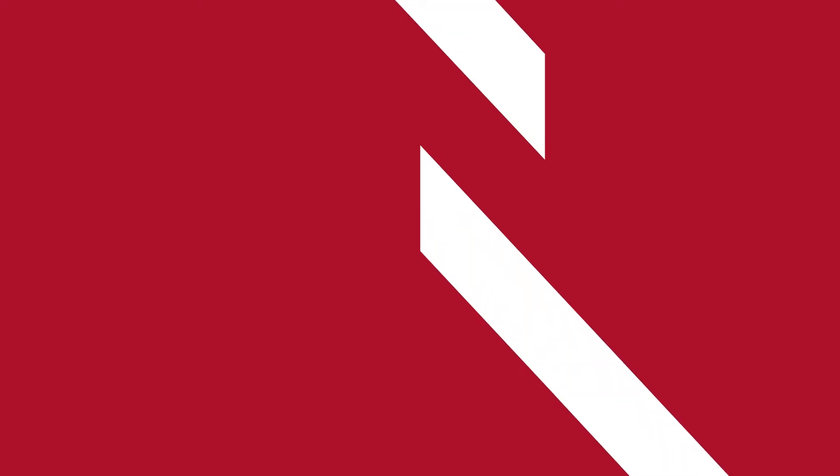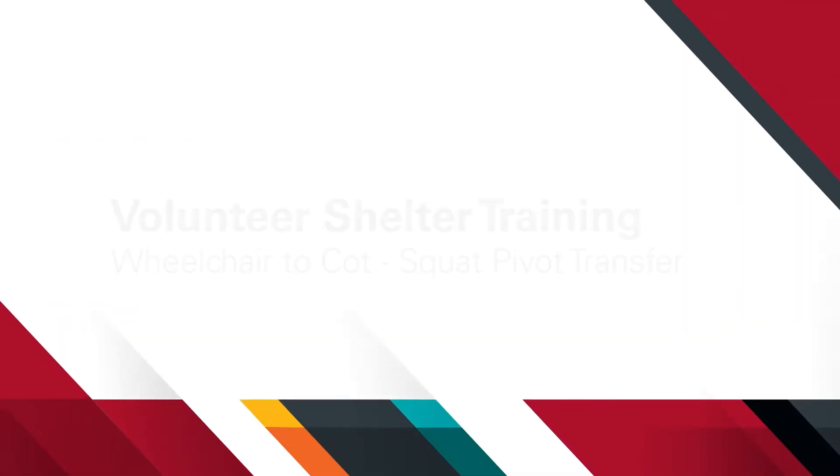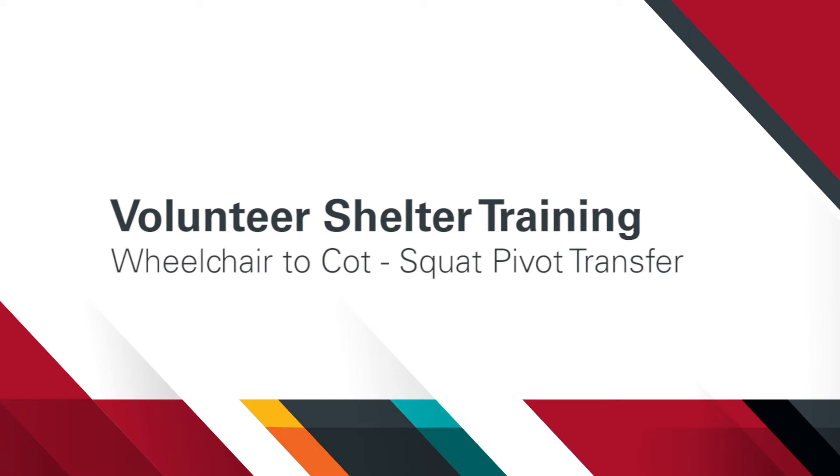In this video, we'll demonstrate how to transfer an individual from a wheelchair to a cot using a squat pivot technique. I'm Natalie Albertson with the Division of Physical Therapy Education at the University of Nebraska Medical Center. Welcome to the training series for volunteers in disaster shelters.